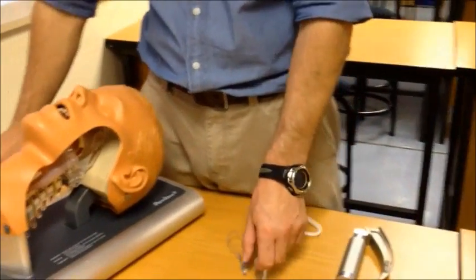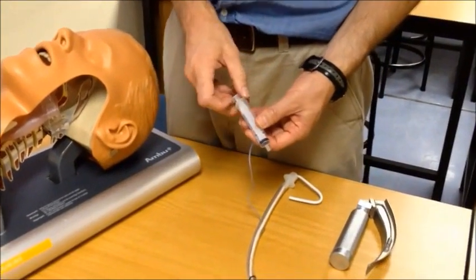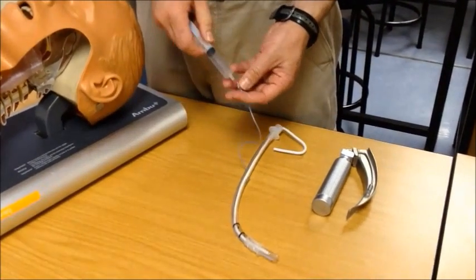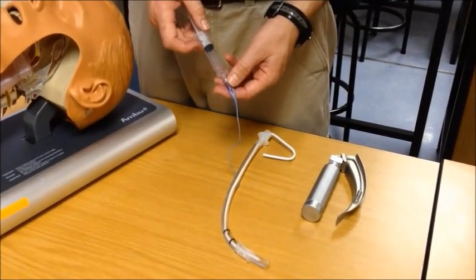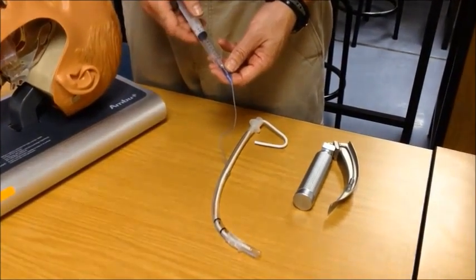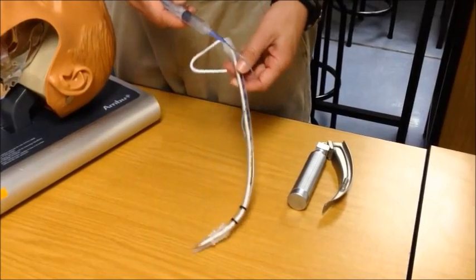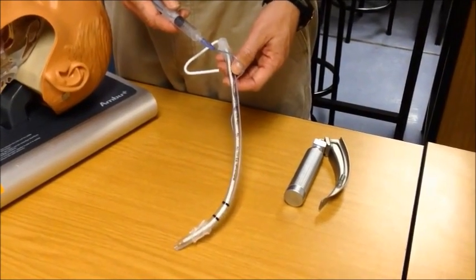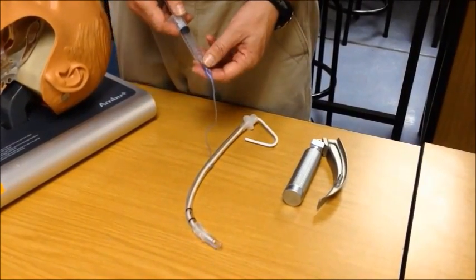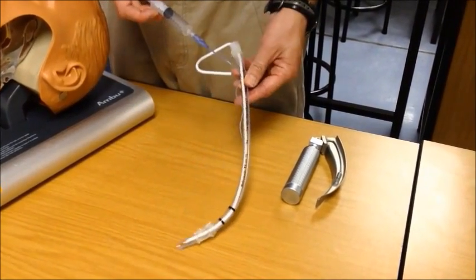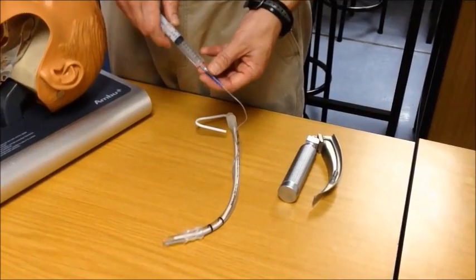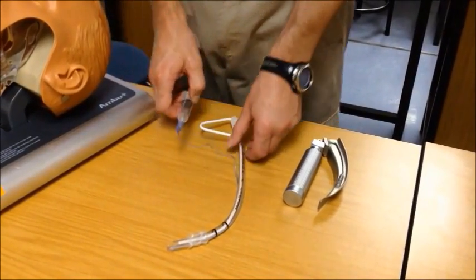Another little trick is to draw up the amount of air you need to inflate the cuff and attach the syringe at this point in time so that it is easy at hand when you need to inflate it. In terms of volume, if your ET tube does not give you an actual volume on it, inflate the cuff with approximately the amount of milliliters of air of the tube size. In this case a 7.5 tube might have drawn up 7.5 milliliters of air.